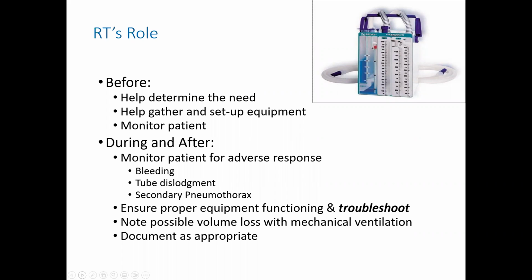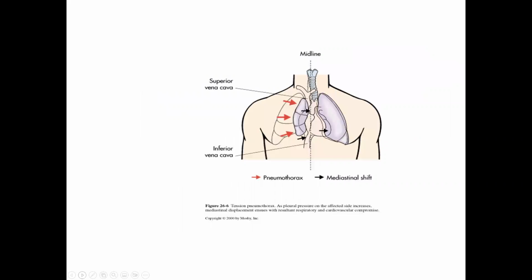But basically, with the patients, some of that volume is going out of the actual chest tube, the evacuation. Documenting as appropriate would be obviously important as well. A little bit of a depiction here, looking at a tension pneumothorax.